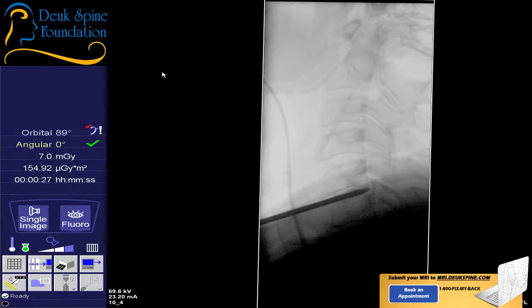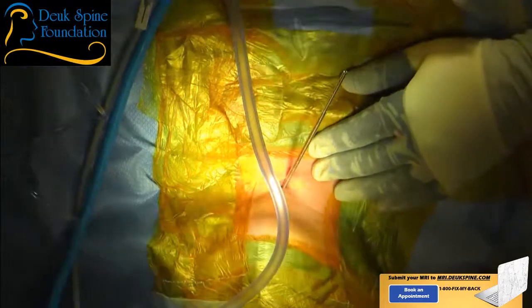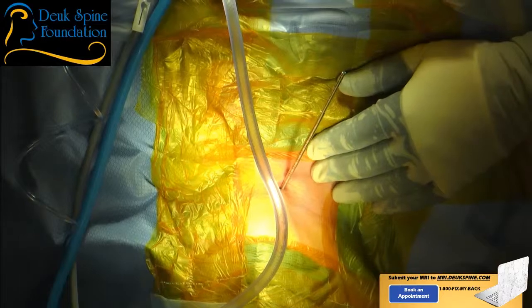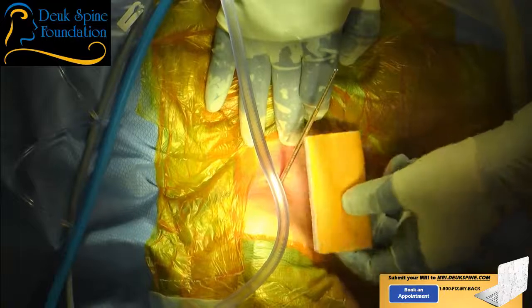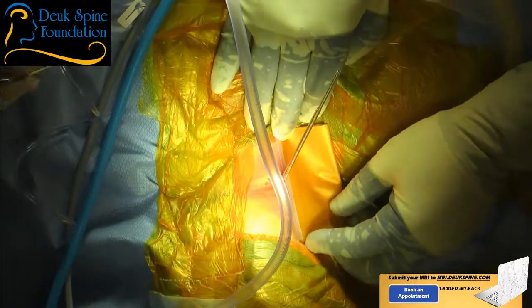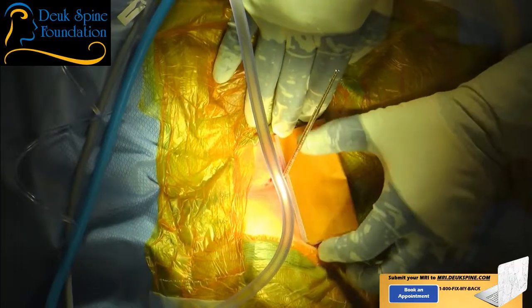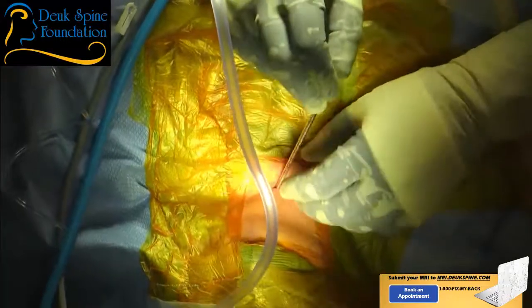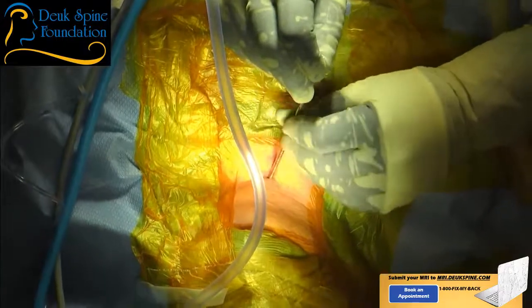Take a look at the incision here, Sean. Let's show the audience how small this incision is. So, you see that? Yes. You have something I could use? Yeah, that's good. All right. So if we were doing an ACDF, anterior cervical fusion, the incision would be this long. Right here. That long. You see that? From here to here. This long. Huge. Why? Because we're doing three discs. And this neck is deep. In other words, a lot of soft tissue.